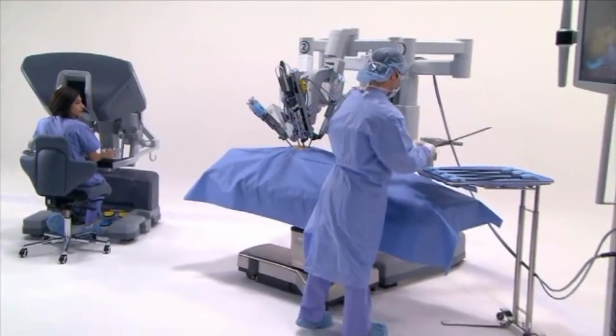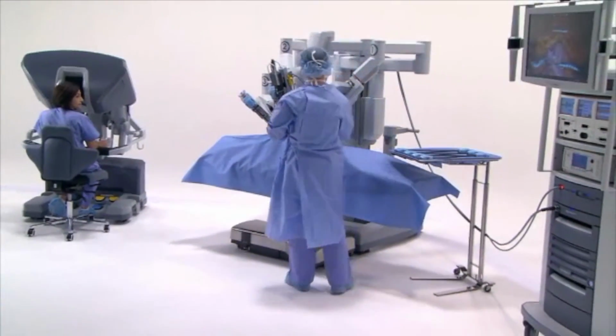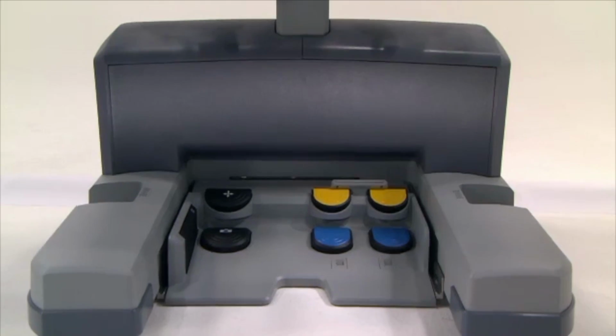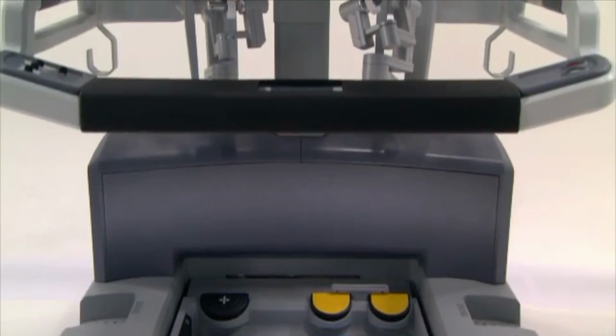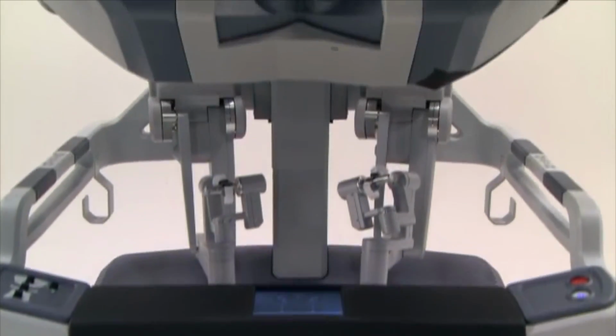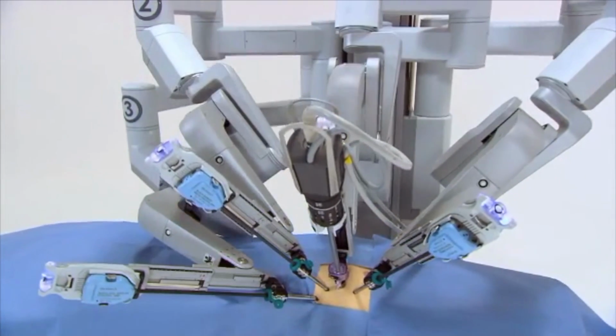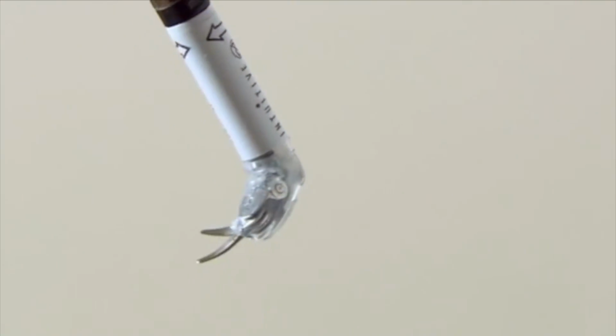With robotic surgery you can do specific, precise, millimeter by millimeter surgery, because the robot machine takes that tremor away. The camera is controlled by the robot itself, and there's a 10 times magnification on the view. The robot's got an arm in the front like your wrist, and it can move 360 or more than 360 degrees. So if you go down into the pelvis, you can turn the instruments up and work upwards and have an upwards motion and put stitches in or cut or remove tissue as you wish to do.